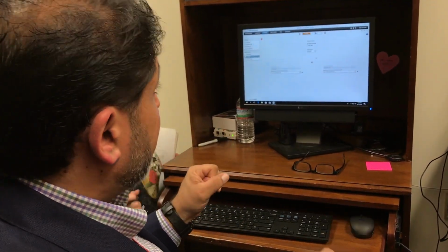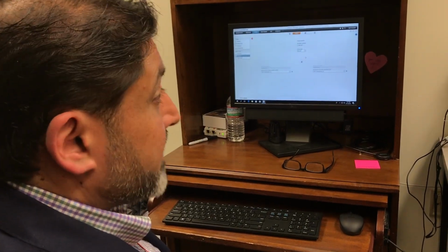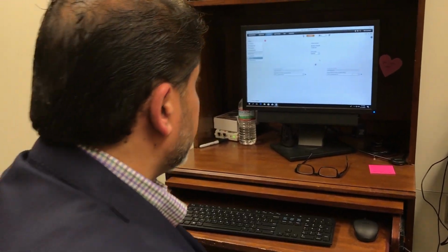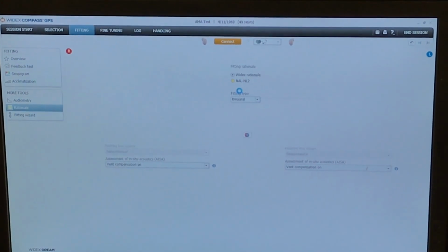And if you're not providing the right amount of gain, what happens to neuroplasticity? Especially in children. So you have to do real ear, which is that thing right behind you there. So we're going to use NAL just because I don't like the Widex fitting formula. I mean, it works for them, but I'm not a huge fan.